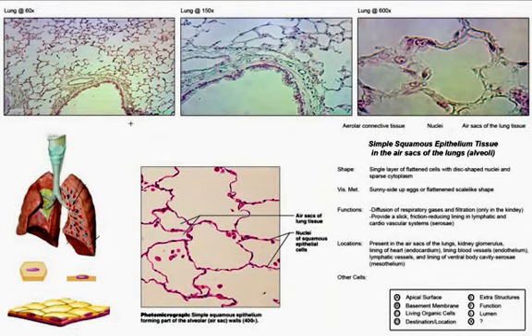All right, so in this slide, this is respiratory epithelia. We're going to see a transition from the trachea here and the pseudostratified ciliated columnar cells that are seen at low magnification right here that line the larger airways like bronchi and the actual trachea itself, into these smaller branches, the primary, secondary branches that we find here. That will transition all the way as you make your way through the respiratory pathway. It'll transition into the deep areas of the lung and eventually become alveoli with simple squamous lining it.